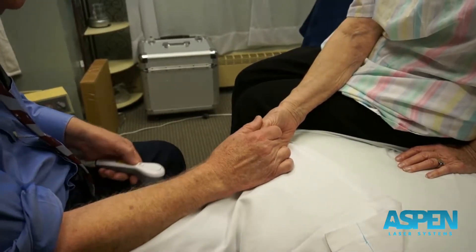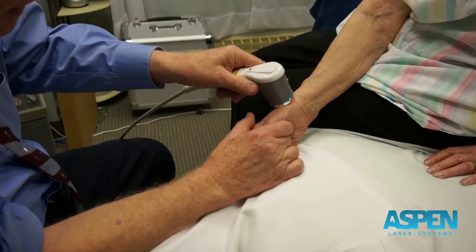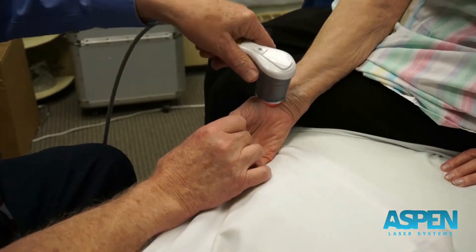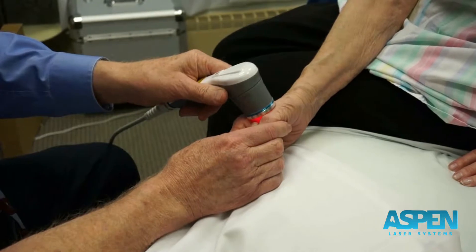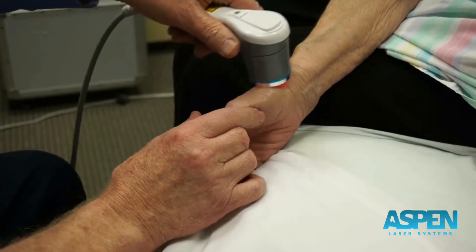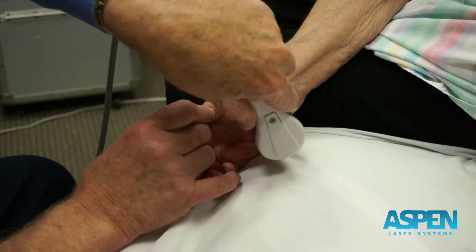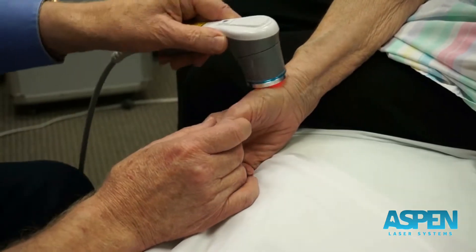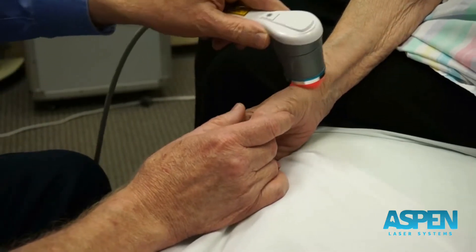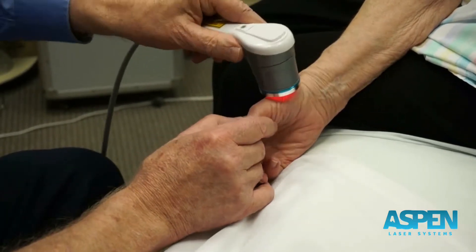If this gets too warm, please let me know. I'm going to try to keep it in skin contact as we work around the joint. One of the things I like to do as I warm this joint up is to put it through a little manual testing to keep a focus on where the pain or the irritation is really coming from.